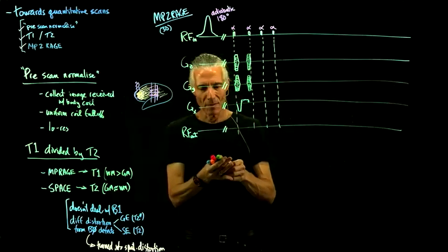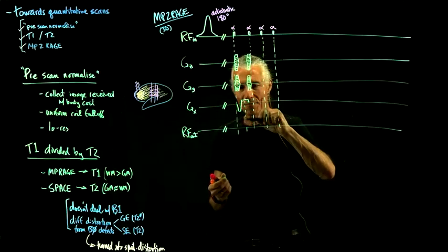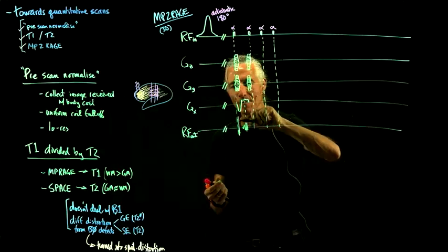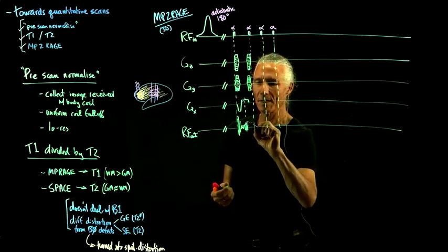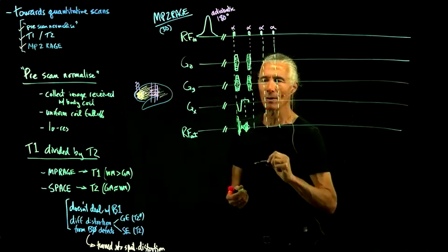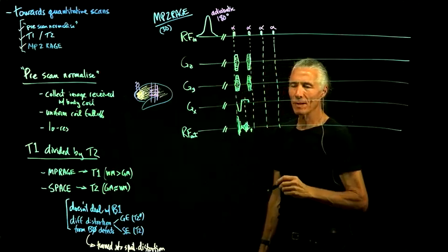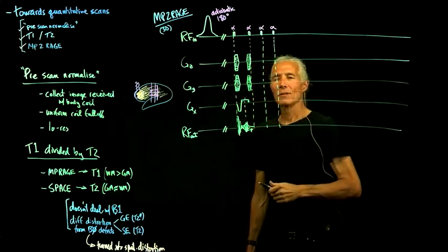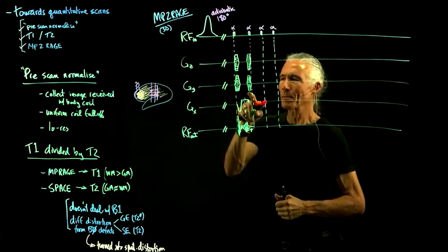And so what is that? That would be like, at this point right here, there's going to be an echo. So there'll be an FID from the alpha pulse, but then here's the echo that you're recording. But at this point in time, there's still some transverse magnetization left, like that. And so we could fix it all up, put it all back into the center of k-space.